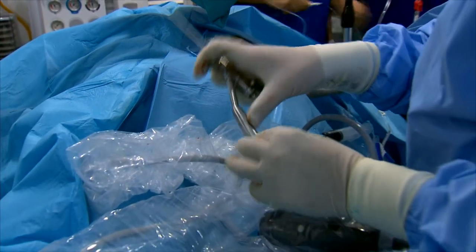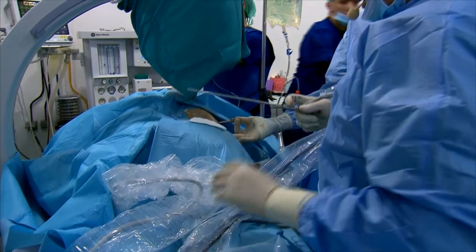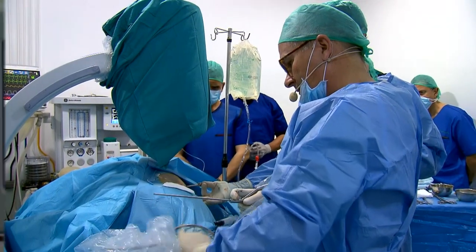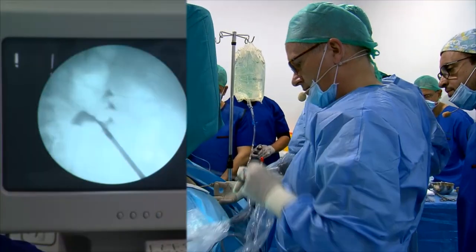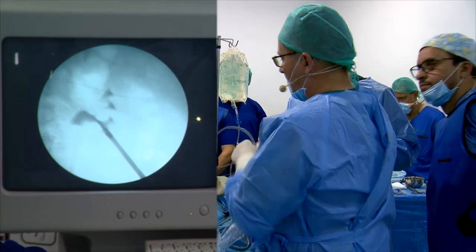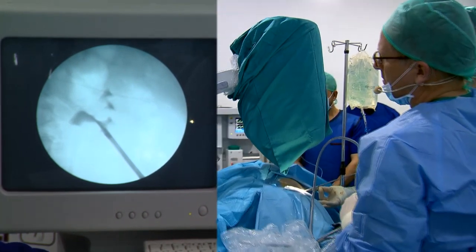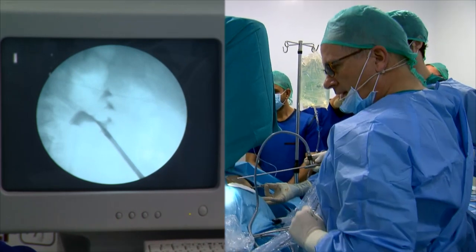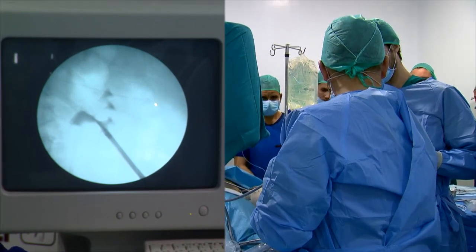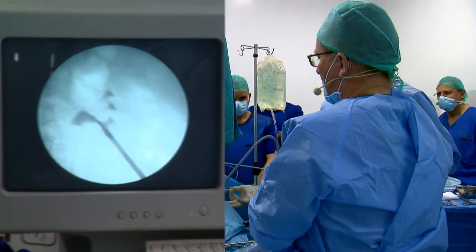We are connecting the mini nephroscope to the camera. Switch the light on, please. White balance. Yes, please, white balance. It's all right. Now we need irrigation. And what we can do is prepare the laser. Five hundred micrometers, yes.